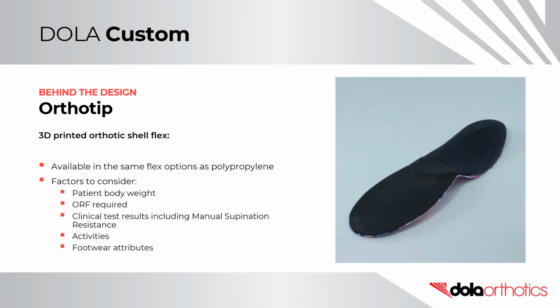3D printed orthotic shells are available in the same flex options as our polypropylene range. Again, factors to consider in this choice include patient body weight, orthotic reaction force, clinical test results, planned activities, and footwear attributes.